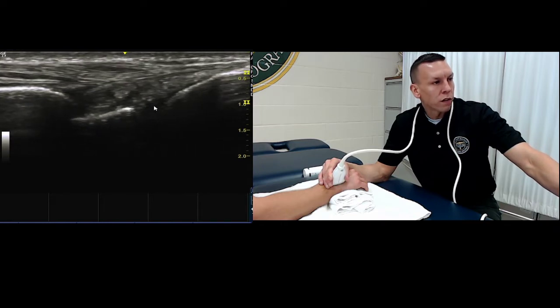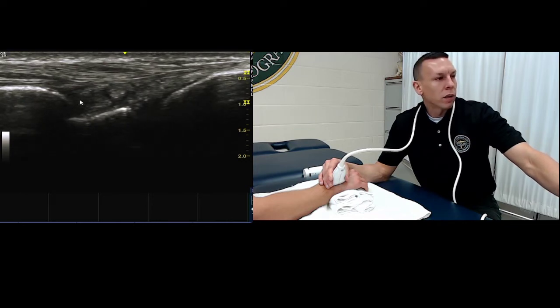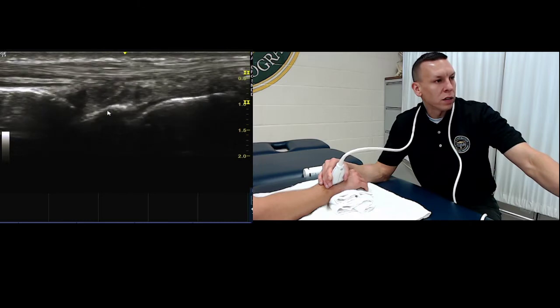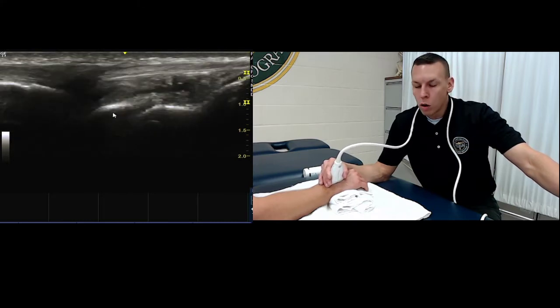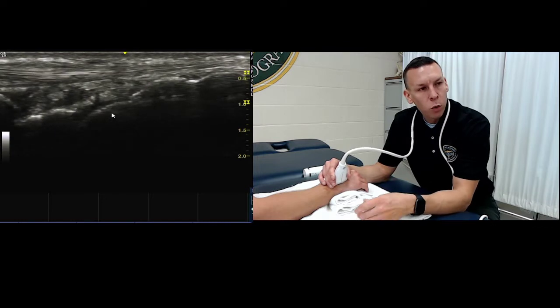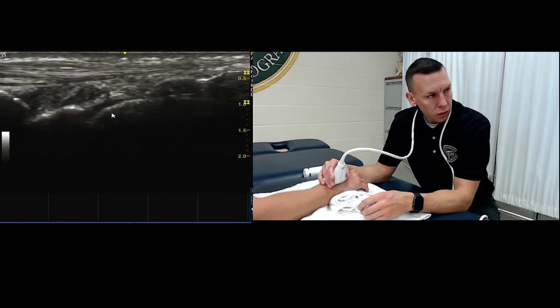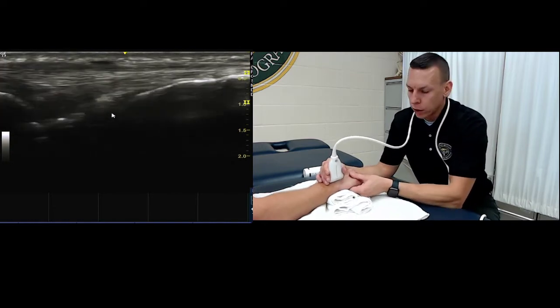So here's where you're going to look for any fluid in these joints, or any ganglion cysts, or any pockets of fluid, or any abnormalities. You can slide the probe and explore. I'd encourage you to identify all the different carpal bones to see if there's any fluid around them or not. But these are the ones I do on every single wrist, at least.